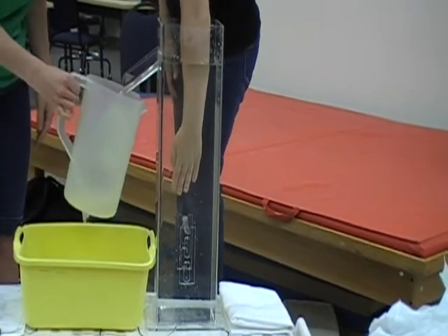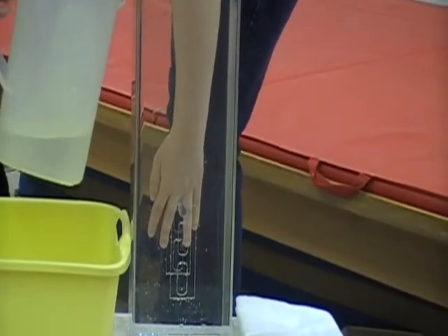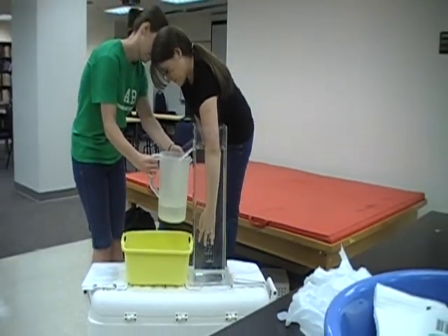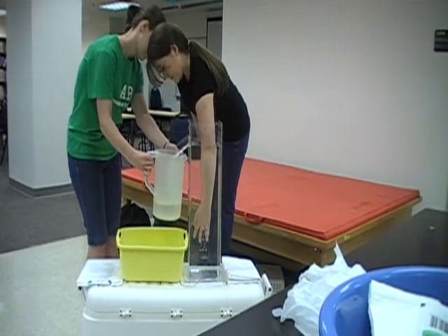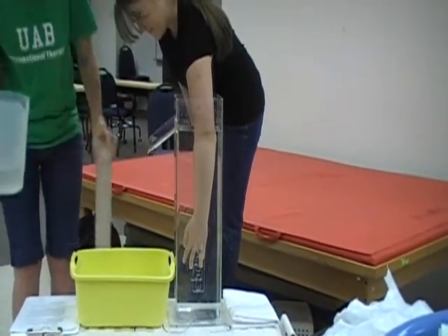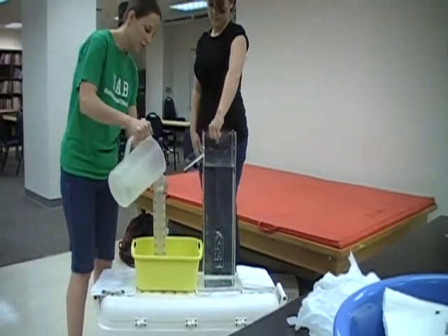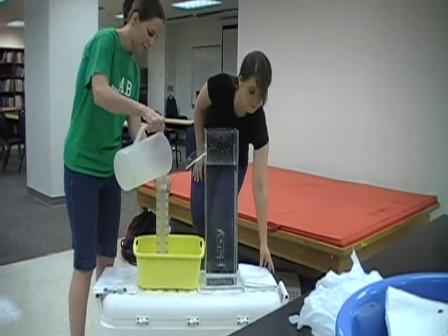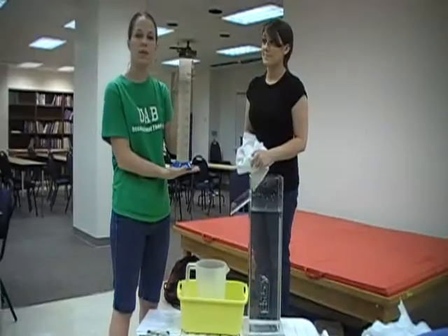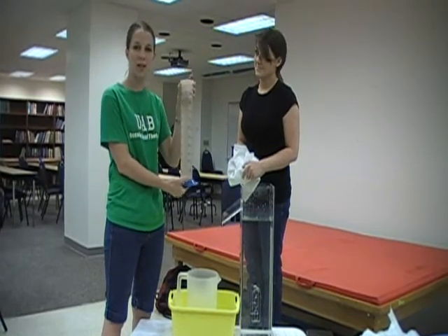You may have to move the container to make sure the displaced water is captured. Next, take your beaker and pour the displaced water into it to measure how much water was displaced. Record the amount of water that was displaced, which was about 960 milliliters.